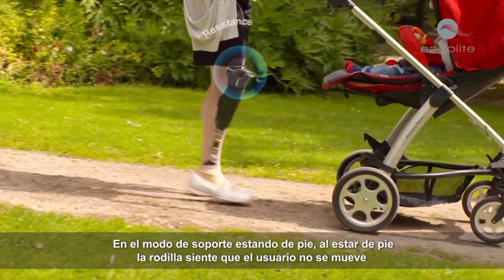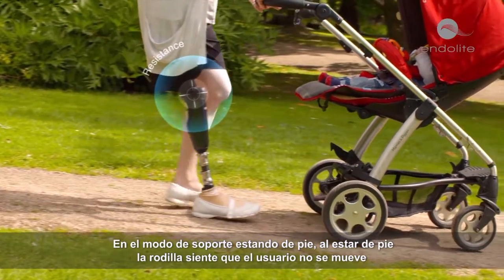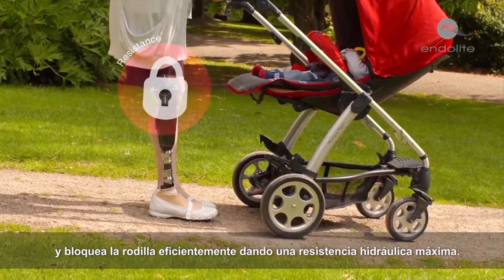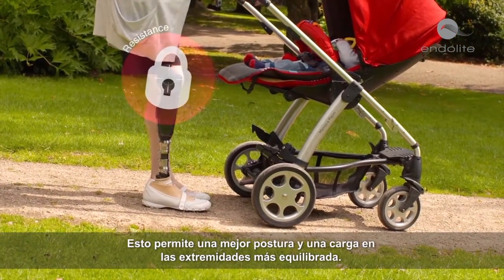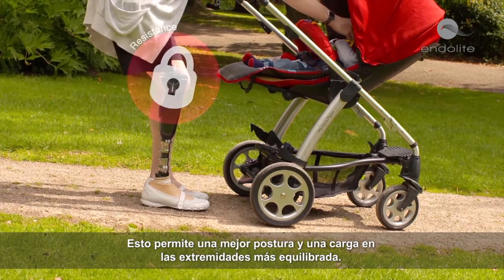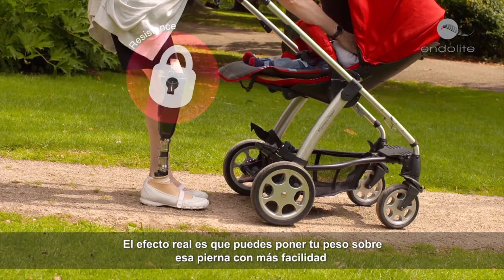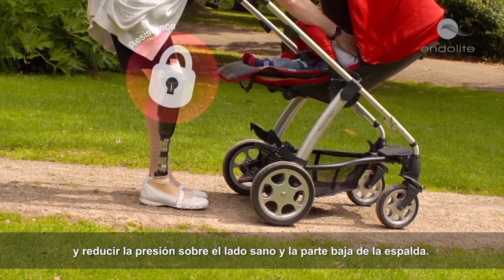In standing support mode, when standing still the knee senses that the user is stationary and effectively locks the knee by providing maximum hydraulic resistance. This allows for better posture and a more balanced limb loading, with the net effect being that you can put your weight on that leg more easily and reduce pressure on the sound side and the lower back.